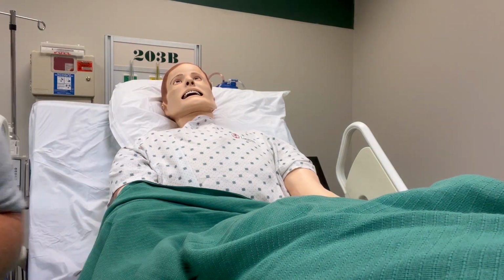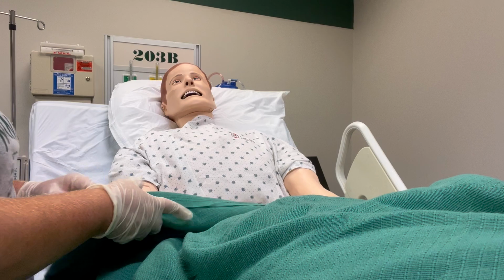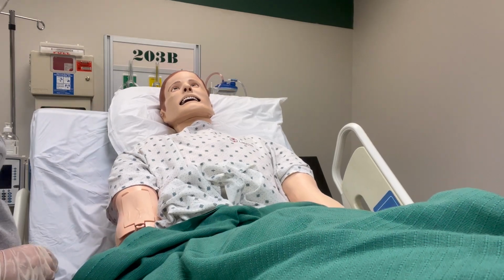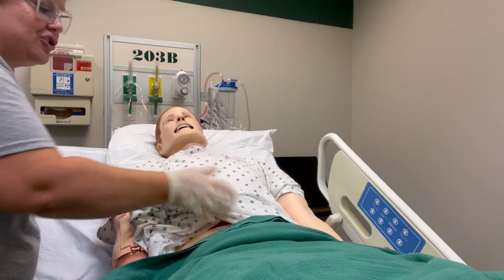All right, Mr. Smith. I'm going to give this in your belly if that's okay. All right. You're okay with them watching? Perfect. All right. I'll keep you covered. I'm going to lay you flat a little bit so that I can get to your belly a little better. So Mr. Smith has done this a few times, so he knows the drill.